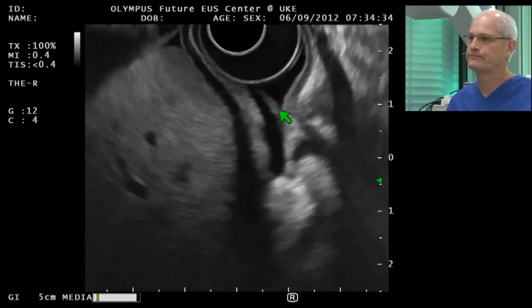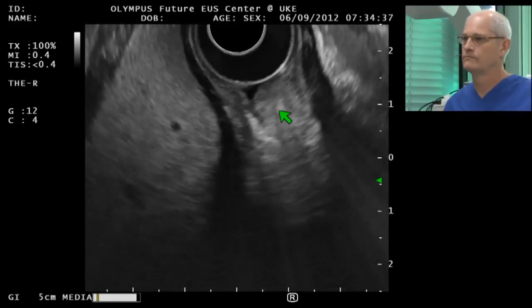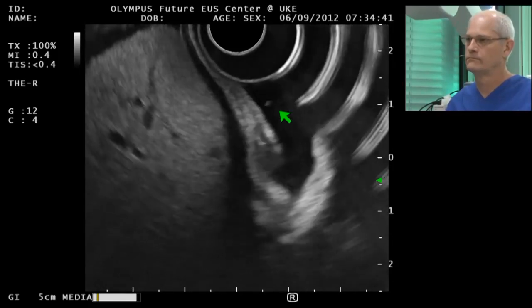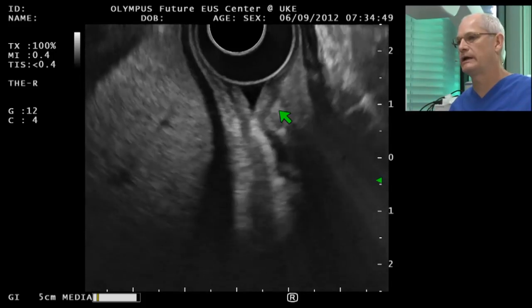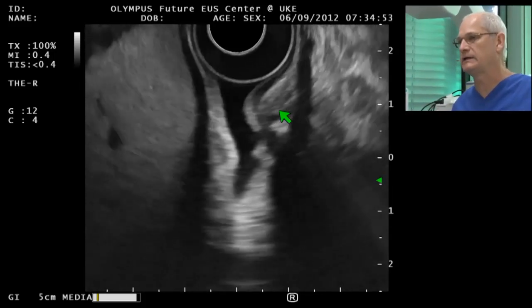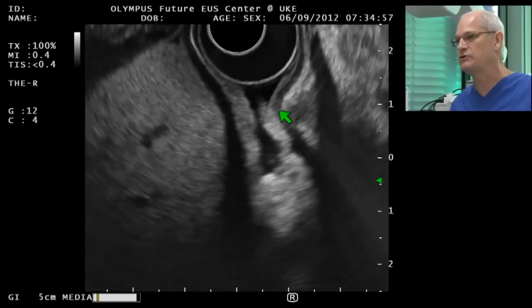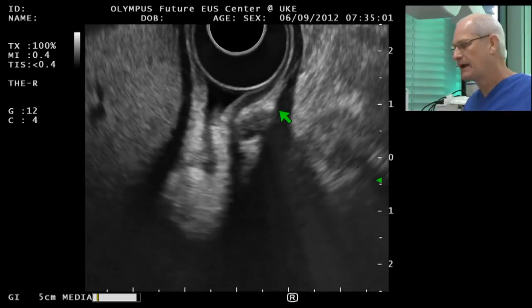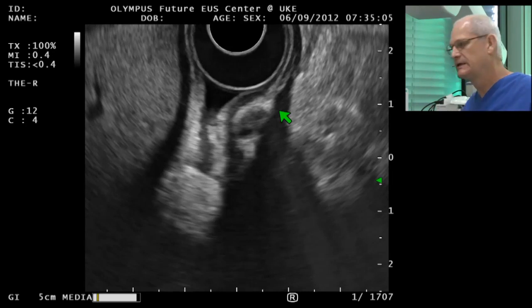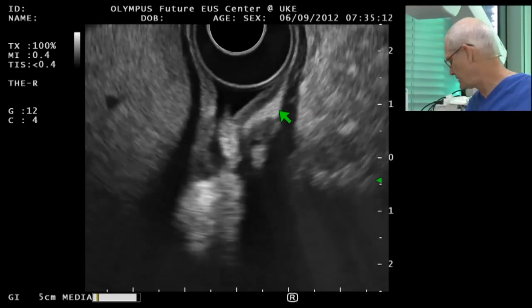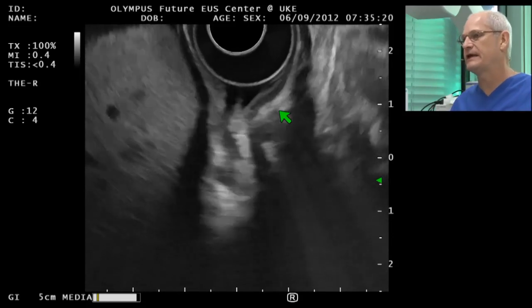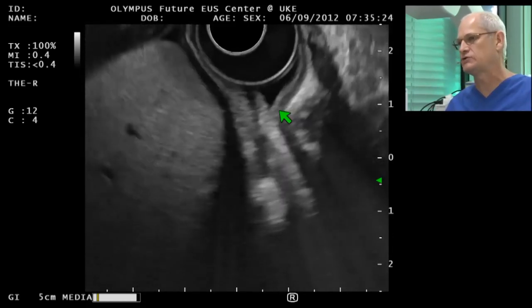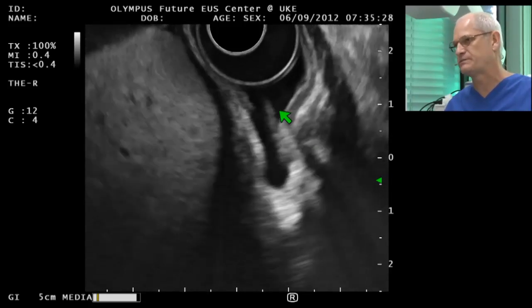Kida speaking: From the viewpoint of Japanese endoscopy, in Japan such a typical ectopic pancreas case will be followed up. Rob: I would agree. This is heterogeneous, it's in the submucosa, there are clearly some cystic areas within it — this is almost certainly a pancreatic rest. The patient is asymptomatic with no symptoms, so this is an indication for just surveillance. I even think that if we survey this a couple of times and there's no change, maybe I would be confident enough to suspend surveillance altogether.